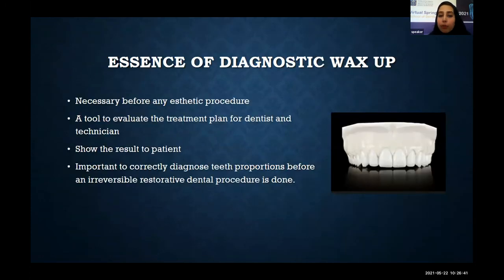So in each aesthetic procedure, we should have a wax-up, a diagnostic wax-up. Actually, it is a tool to evaluate the treatment plan for dentists and technicians. And we can show the result to patients. And it's important to correctly diagnose this proportion before any irreversible restorative dental procedure. Means that we can get a vision about our planning, if aesthetic crown lengthening is needed or orthodontic treatment is needed before aesthetic smile design, we should consider in this step.